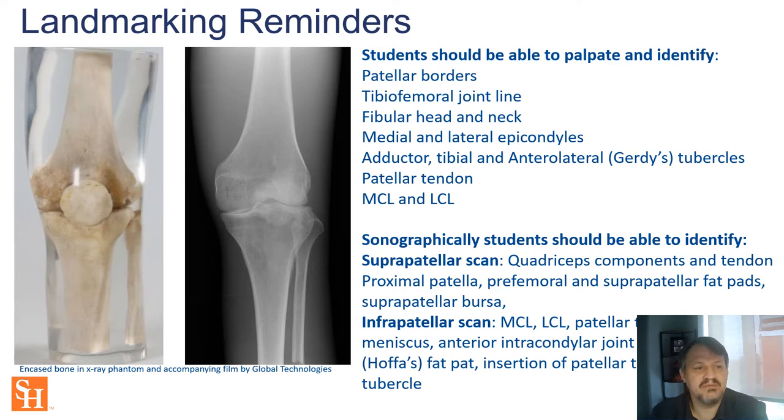This is an image of a commercially available phantom with real bone embedded in a translucent acrylic medium that shows up the same as it would under x-ray, just as it would in a real living human. When thinking about which landmarks to use for identifying blind or ultrasound guided injection, you should consider the following things listed here.